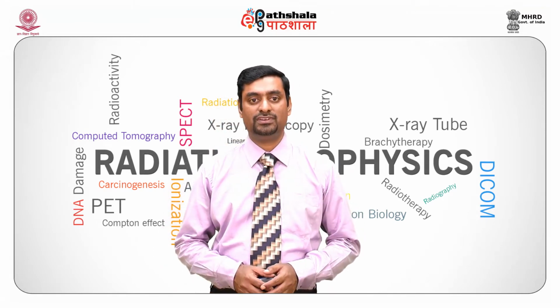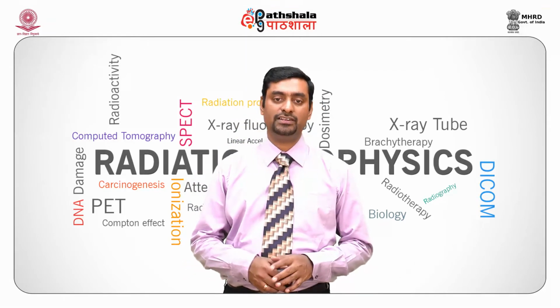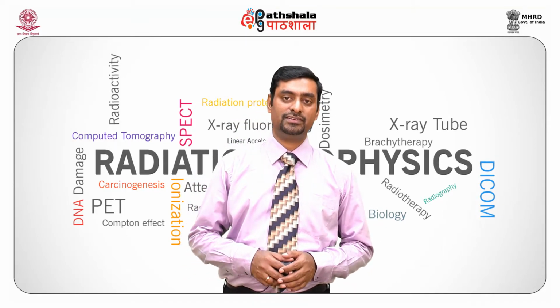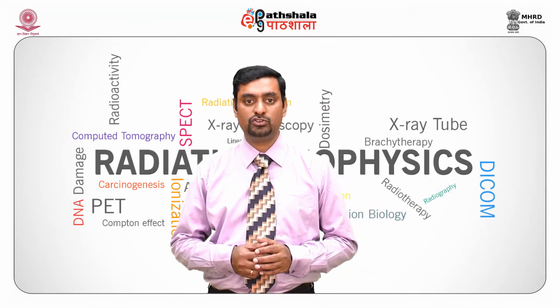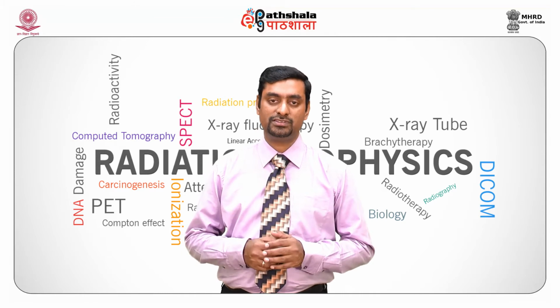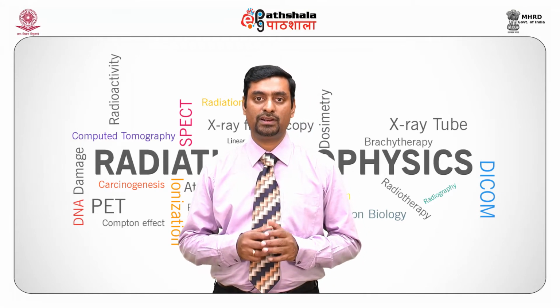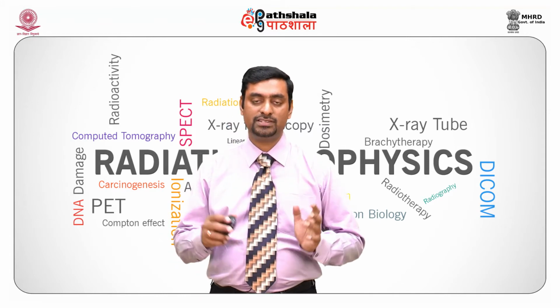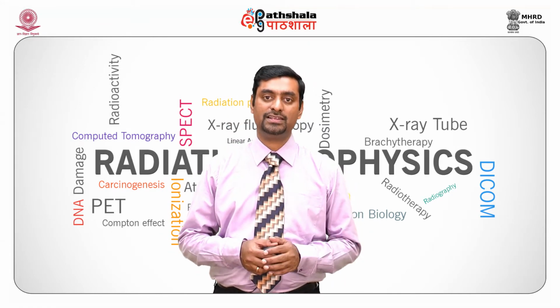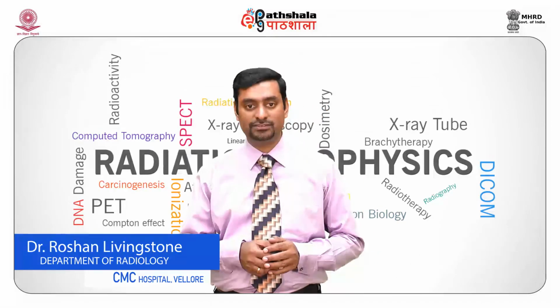We then move to the image intensifier. The function of the image intensifier is to convert incident X-rays into a visible light image to be viewed using monitors. It just resembles an old fluoroscopic screen. However, this image that was converted to light has to be converted into electrons so that you are going to get a digital image.